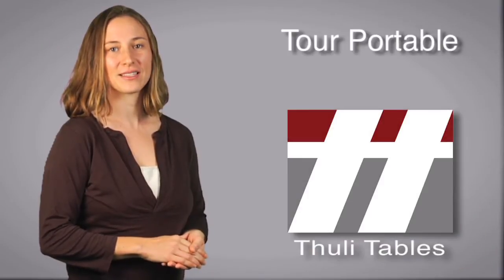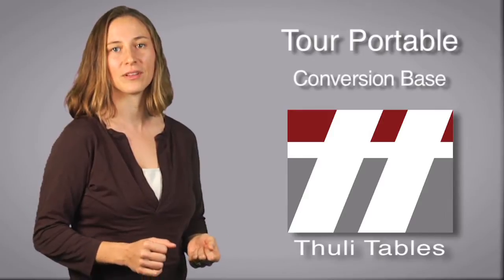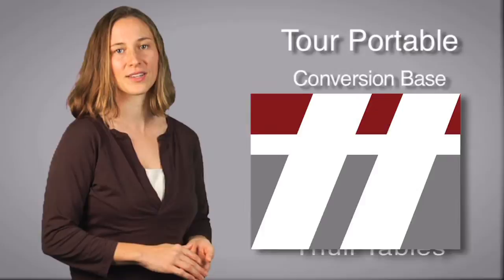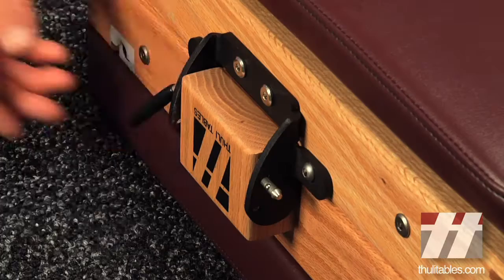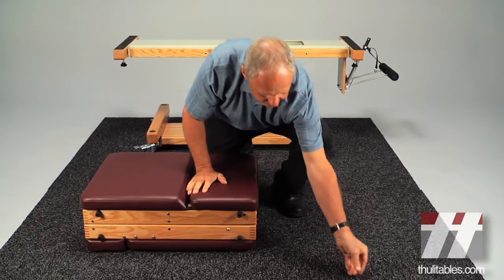The unique Tour conversion base allows you to quickly convert your Tour portable table into an elevation table. Chiropractor and designer Dr. Rick Tooley will show you how it works. Your Tour portable table can be mounted to a conversion base to allow it to be used as a standard office table without sacrificing portability. The model shown here is equipped with the optional locking wheels.